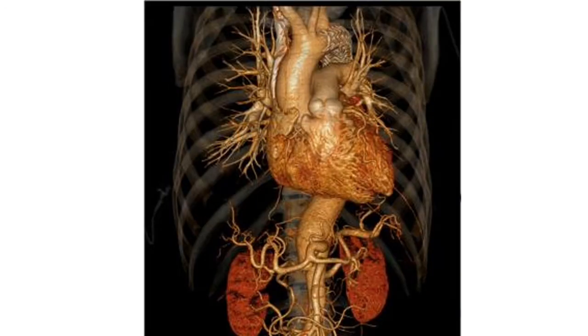In the cath lab, you will be exposed to both transfemoral and transradial catheterization, although the latter is our favorite. With transfemoral, you can have a relatively easy time engaging the vessel. The catheter seems to follow the path of the aortic arch quite easily. With radial catheterization, it may not be quite so straightforward. The catheter may have to effectively bounce off walls of the aorta and have to negotiate tortuosities. But you should persevere because this is truly the better way to do these procedures.